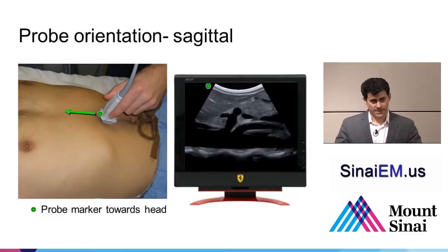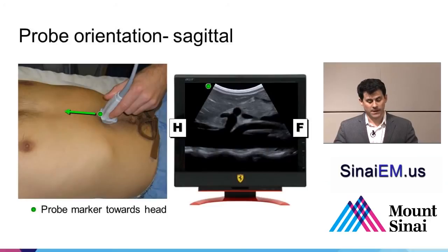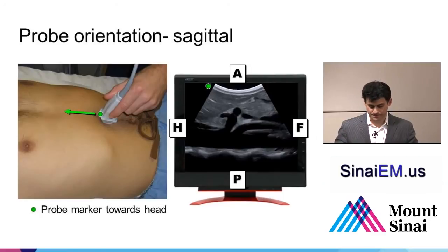So the utility of this is, in this sagittal view, for example, through the aorta, when you hold the probe marker towards the patient's head here in your hand, it corresponds to the probe marker towards the patient's head here on the screen. That means the opposite direction away from the probe is towards their feet. And you can just look down at your hand and get the rest of the orientation. The part of the probe that's touching the patient is generally going to be superficial or anterior, depending on how you're holding the probe, and therefore anything away from that side of the screen is going to be posterior. So just by holding the probe marker correctly, we know head and foot, anterior and posterior, and we can orient ourselves through this aorta with its proximal branches very well demonstrated.